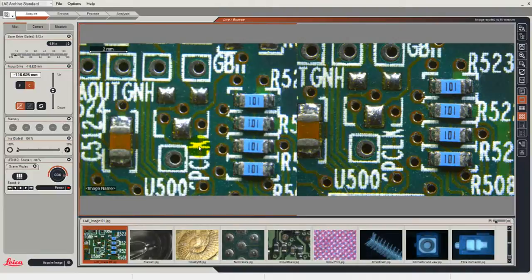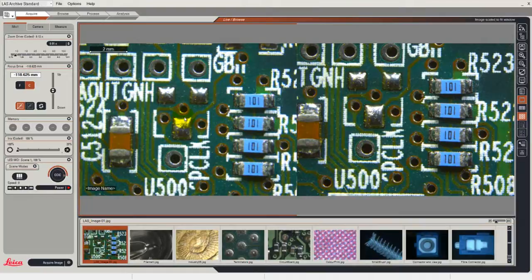What is particularly convenient about this is that I can acquire an image and at the same time compare it with the image on the right hand side. And even when I acquire the image I can immediately see the image that I have acquired. But to do that I need to make an adjustment to the way in which the acquisition is performed.